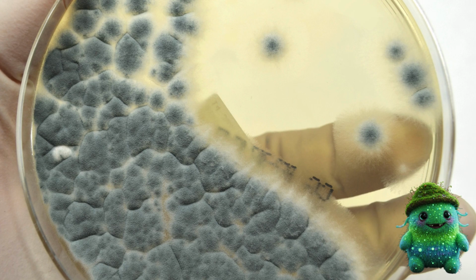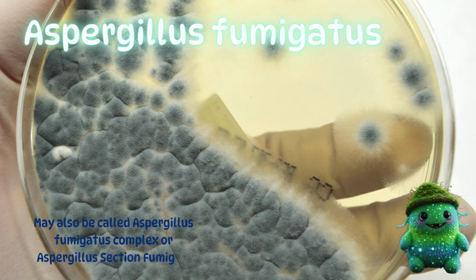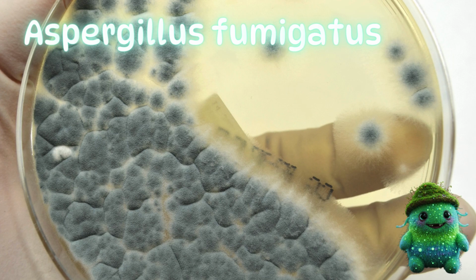As one of the most common mold isolates overall and one of the most common pathogenic molds, Aspergillus fumigatus comes in at number 1. I often think of Aspergillus fumigatus as the Staph aureus of molds. This will make sense if you've had bacteriology. Basically, it's the go-to pathogen for this group. It is the single most common cause of invasive disseminated aspergillosis, allergic aspergillosis, and fungal sinusitis. The colony, pictured here, is usually described as a smoky gray-green, blue-green, or forest green colony.